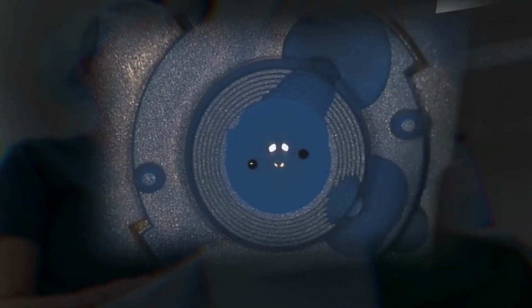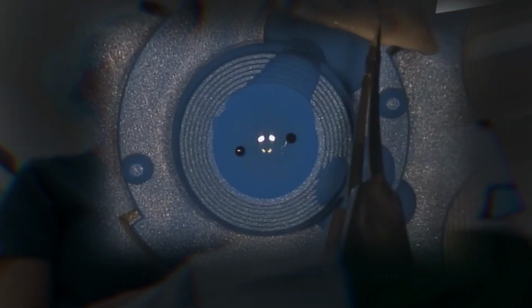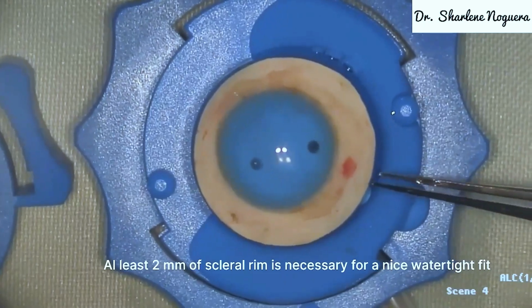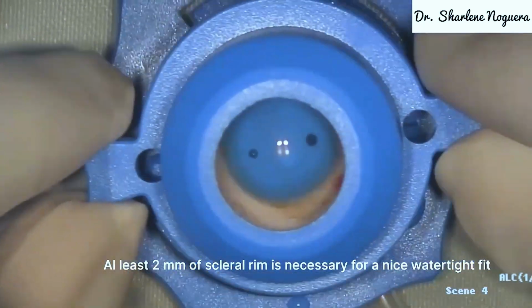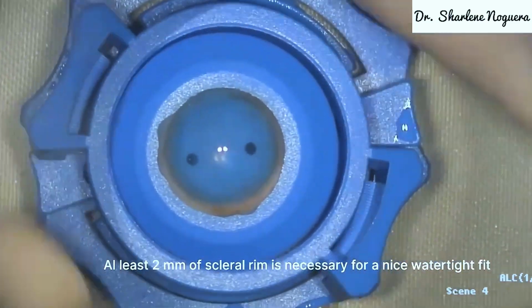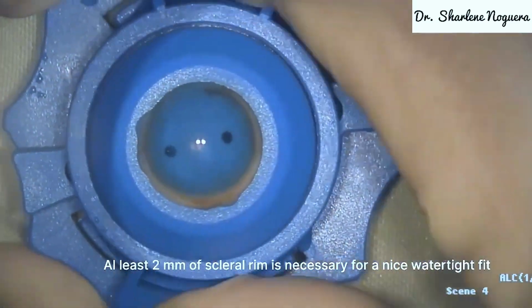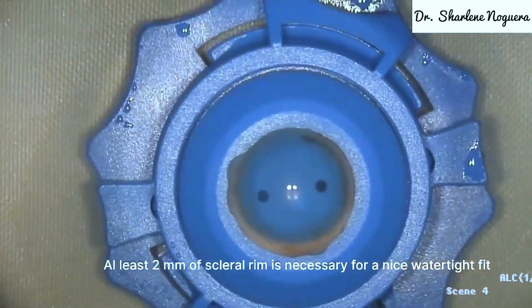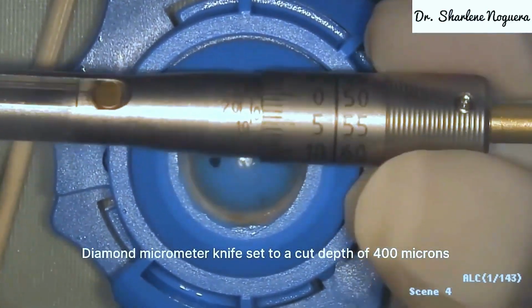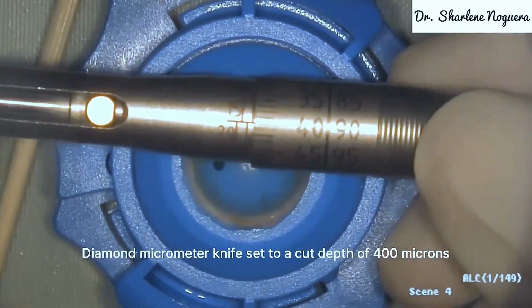Mounting of the donor corneoscleral rim was done on a barrel artificial chamber with the use of cohesive viscoelastic to protect the endothelium prior to mounting. At least 2 mm of scleral rim is necessary for a nice watertight fit. The epithelium was then removed. A diamond micrometer knife was set to a cut depth of 400 microns.